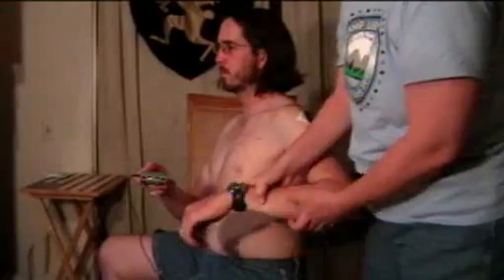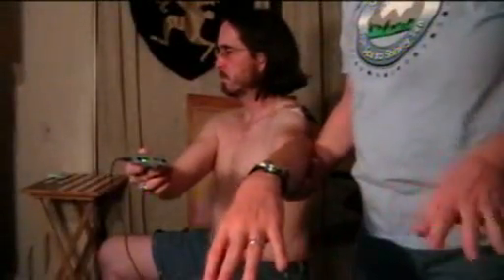First thing I want you to do is take the arm — hopefully we have the range for this — straighten it out to the side, and have the person try and find the muscle here. Some people are able to discover the muscle and get the brain to contact the muscle here by wiggling fingers, trying to do little circles with the arm, thinking 'reach out and touch a hand with the fingers,' trying to move it up and down — various things. Try this for like two or three minutes.